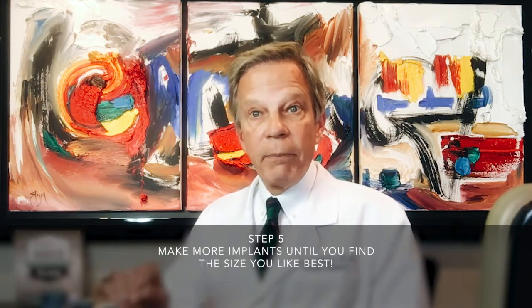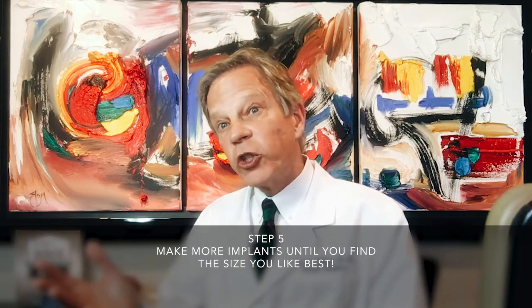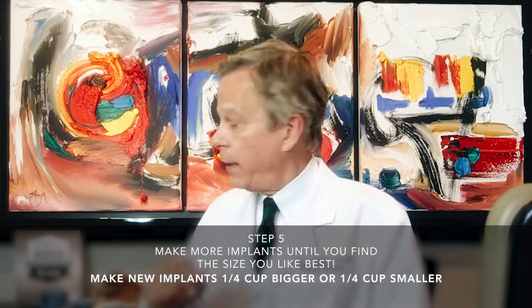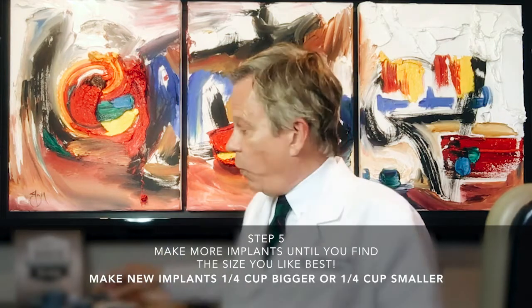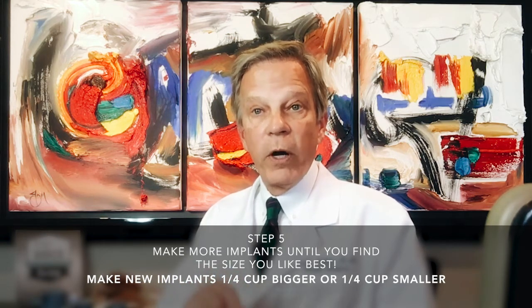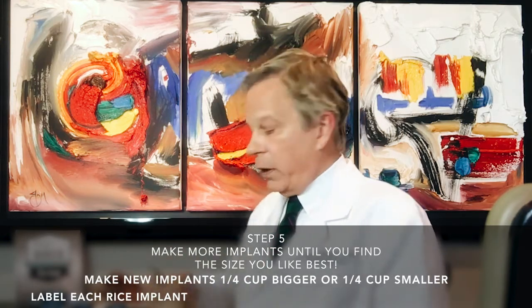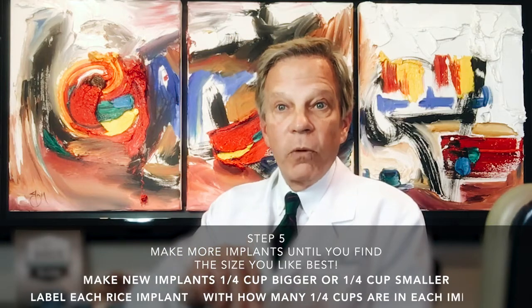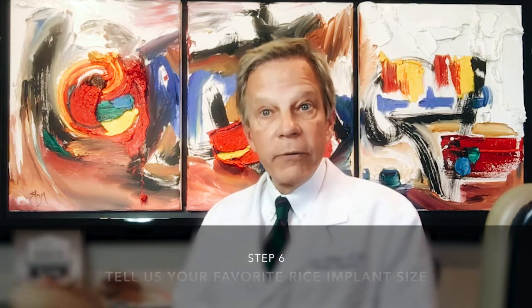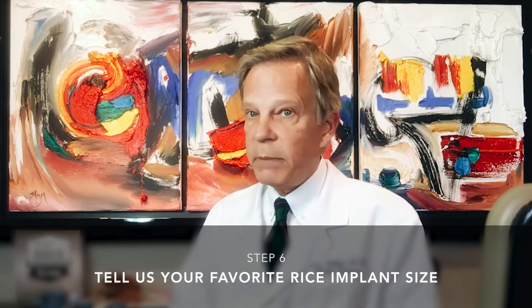Once you start with your cup and a half of rice, decide: do you need more, do you need larger, do you need smaller? You can adjust by quarter-cup increments. The quarter-cup difference from one size test to another will help better determine where we want to end up. You can either open the knot and add or subtract rice by quarter-cup increments, or you can make another set. If you make a second set, mark them on the outside so you know which is which, because sometimes it's hard to tell the difference.